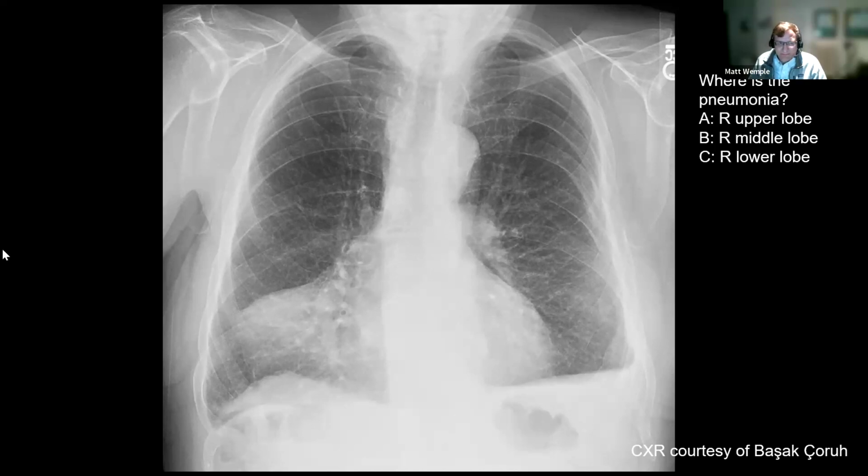Okay, how's the poll going? We are good. I'll close it. Okay, awesome. So 67% said right middle lobe and 33% said right lower lobe.